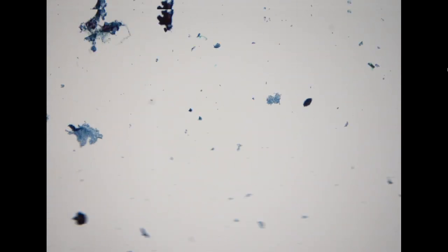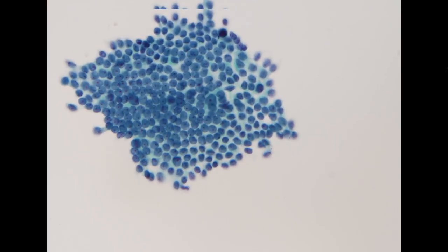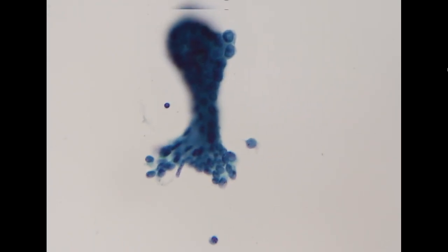And then we just need to check if we can find pseudoinclusions somewhere. Sometimes it's not easy, but almost every cell in this specimen has the nuclear features of PTC.